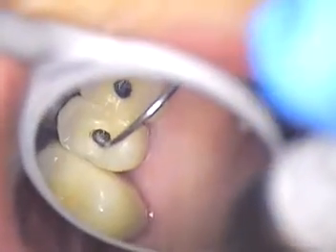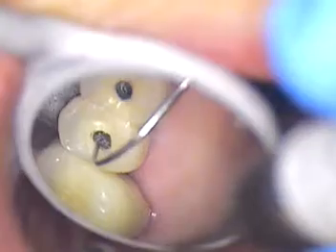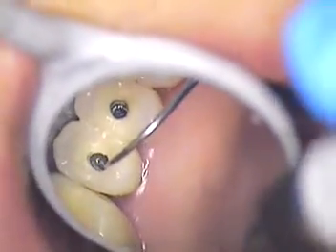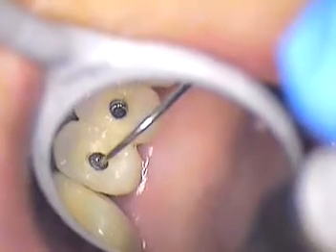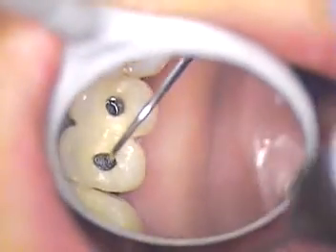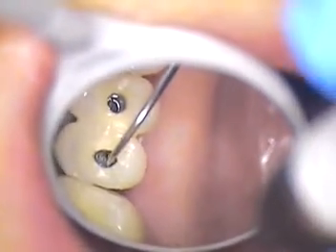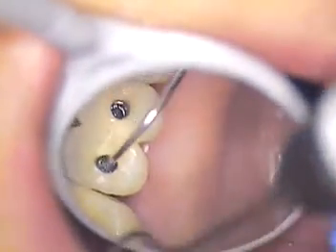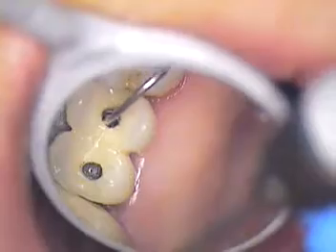Clockwise is counterclockwise in the mirror — everything is opposite. So we'll be spinning the screw out in that direction. The other one I've been turning already.